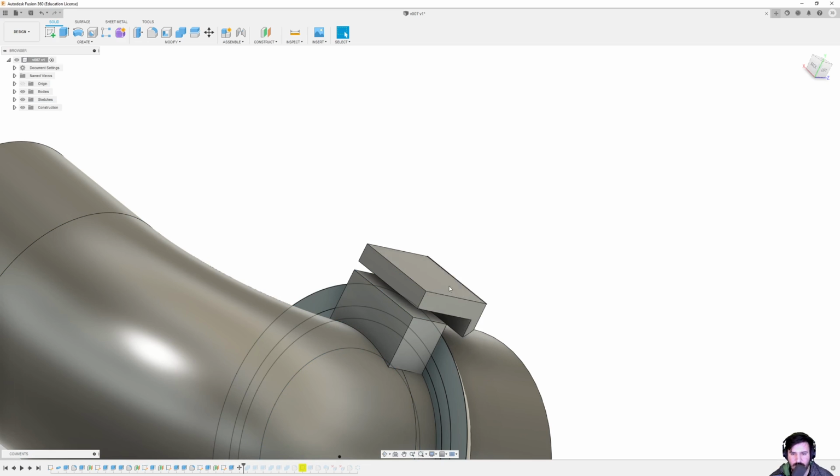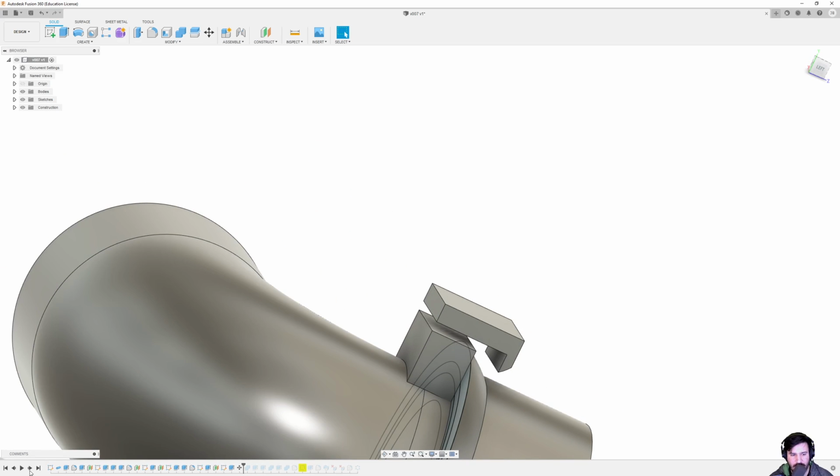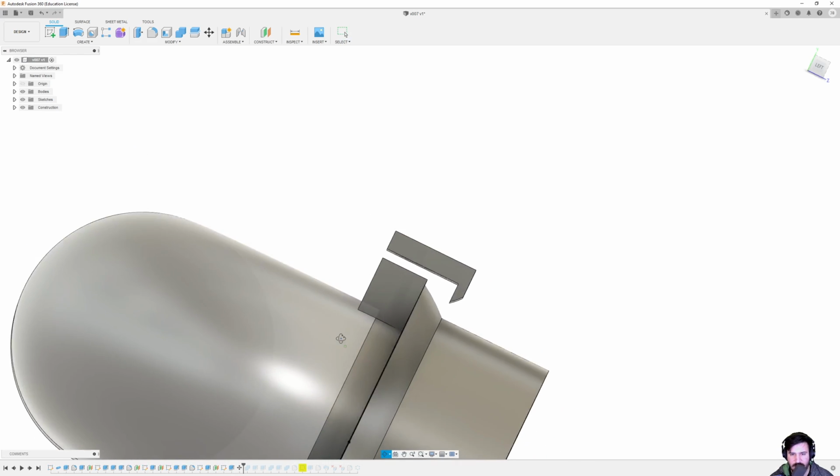Next, I moved this top piece up a little bit. If I pop back, you can see exactly what I did. It was too close. So this allows it to, in fact, I thought I had moved it closer. So I guess maybe after moving it closer, I determined that it was not correct.